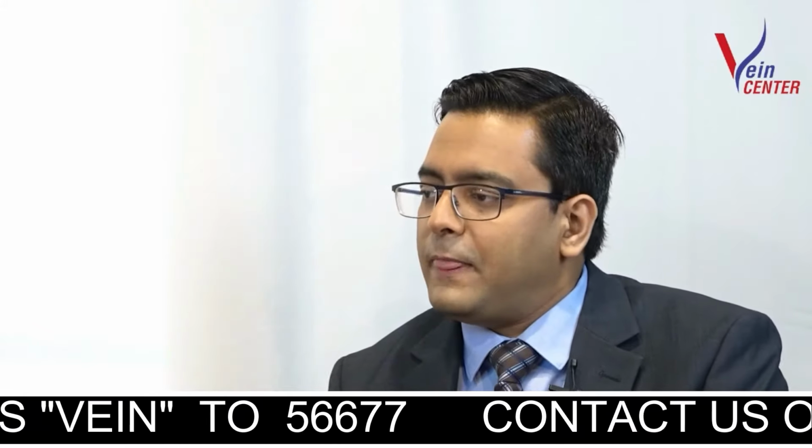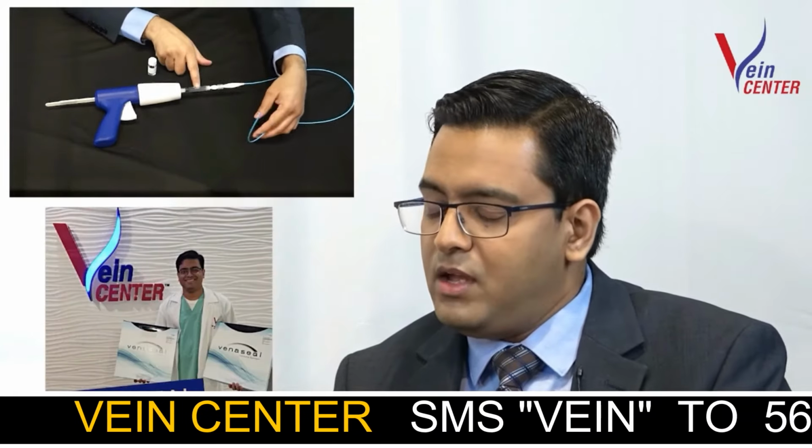But now the world has moved forward. The current best ways of treating varicose veins do not even require heat. We do this through a pinhole and IV line needle, but there is no need to burn the vein. This is called non-thermal ablation, and the current standard of care for treating varicose veins by non-thermal ablation is a procedure called VenaSeal. We are sealing the vein by using a particular kind of medical glue.